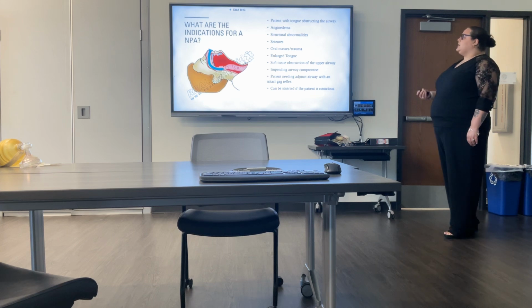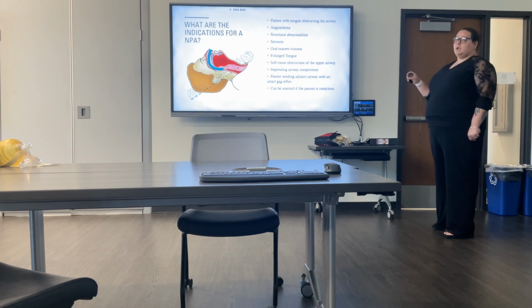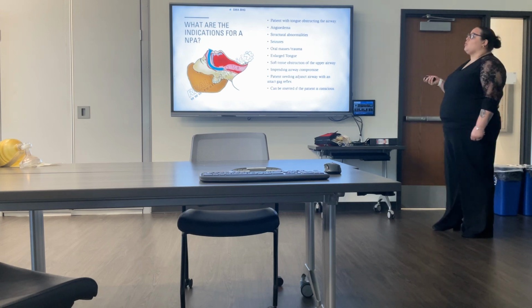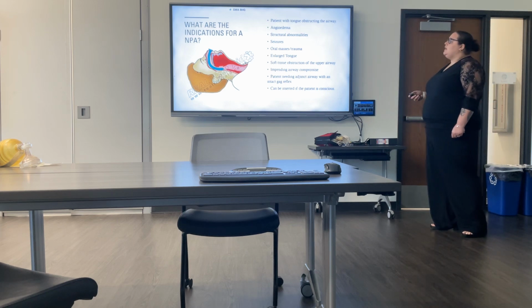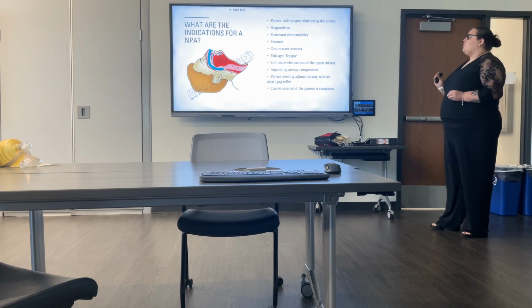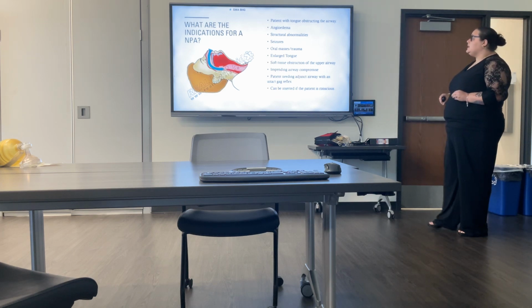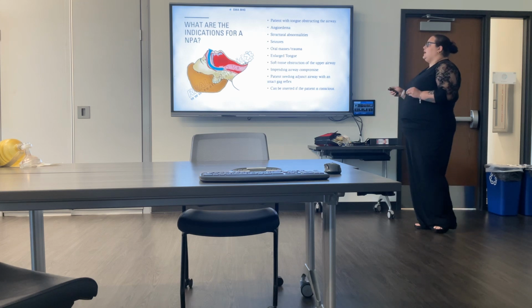If they bite and clench when they're having a seizure, they can break off a piece of plastic of the OPA and swallow it, or you risk breaking their teeth and them swallowing their teeth and causing more oral trauma. Any kind of oral mass or trauma, if there is a mass in the airway or in the mouth, you do not want to disturb that mass. You want to leave it as it is and try to facilitate around that mass what you can.